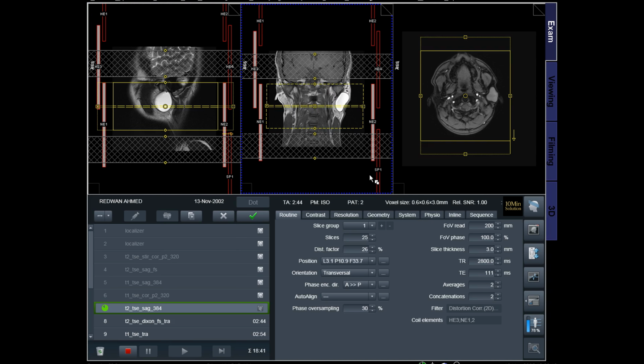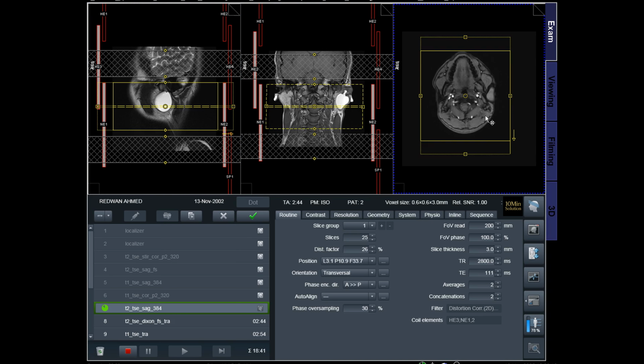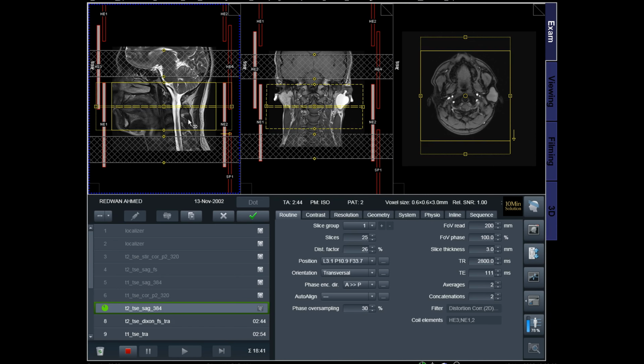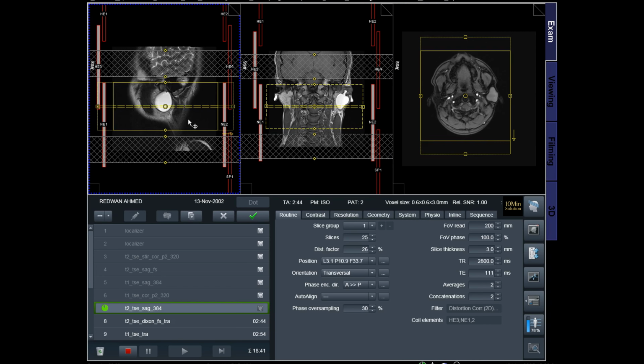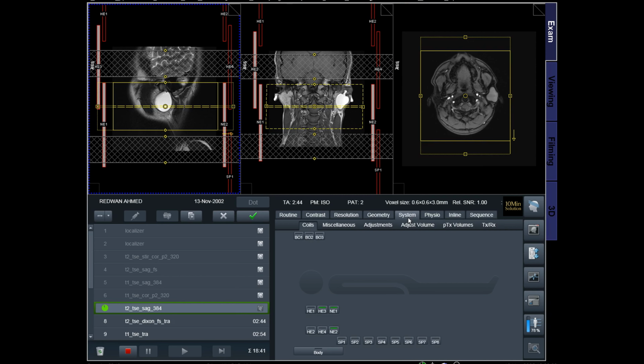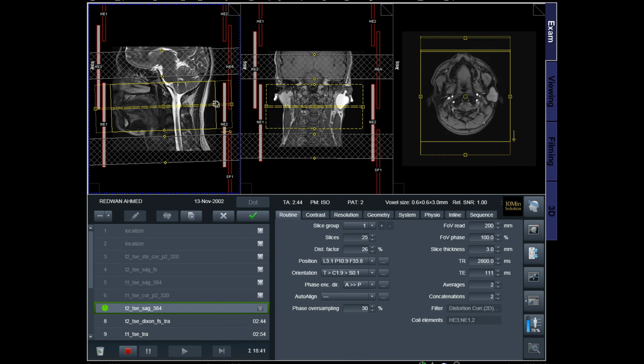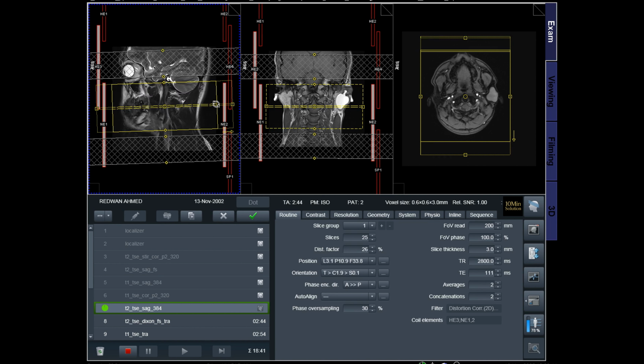Welcome, everyone. In today's calm and focused session, we will explore the MRI of the parotid gland, a small yet significant gland that supports every smile, every conversation, and every bite we take. MRI opens a clear window into this delicate structure, revealing details that no other imaging can show. Let's begin this elegant journey into head and neck imaging.